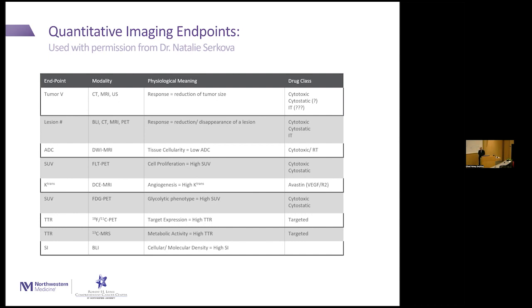There's still, so you can still perturb the water and get a sense of the movement of water. You're right, it's not the same thing ex vivo, but water, there's still diffusion in samples. So you can do DWI on a sample. Doesn't even have to be a biological sample. Of course, it's less meaningful ex vivo than in vivo.